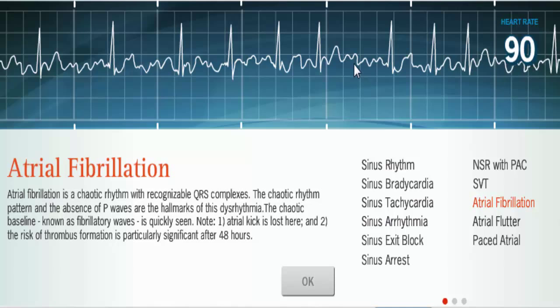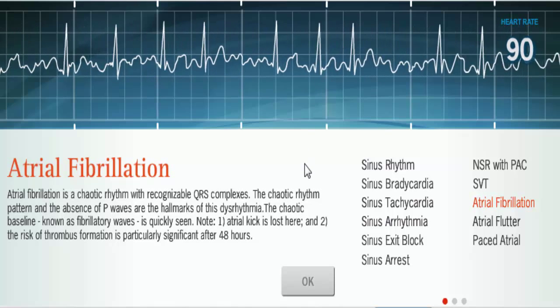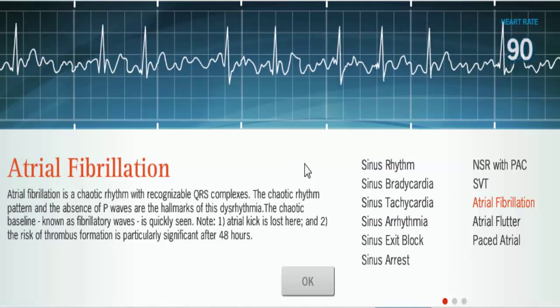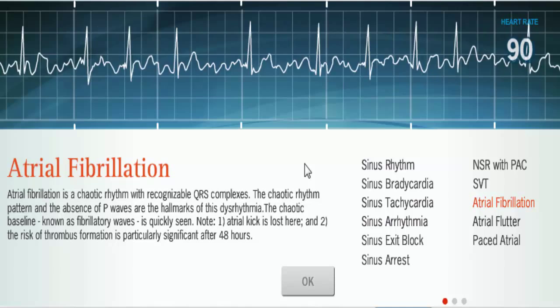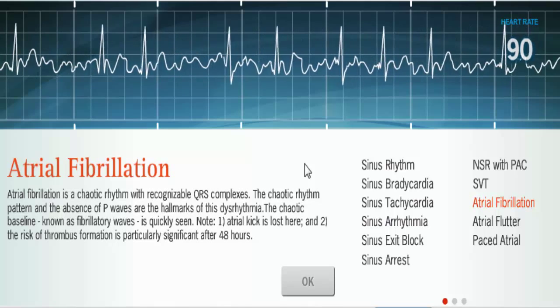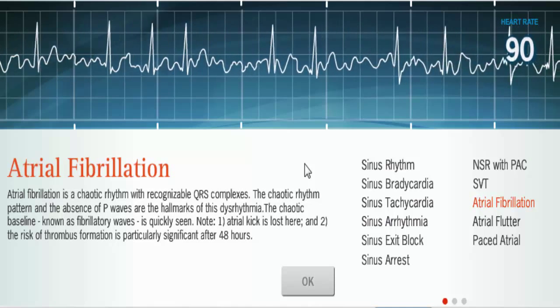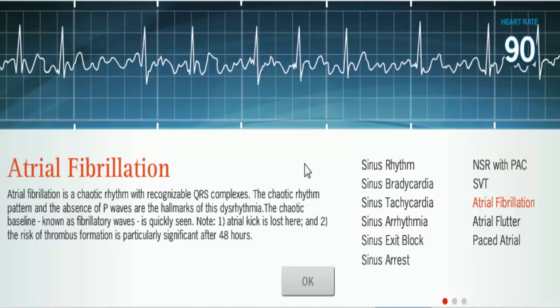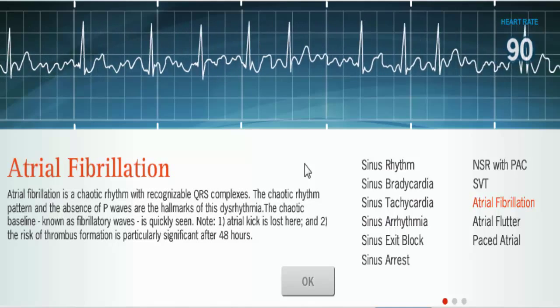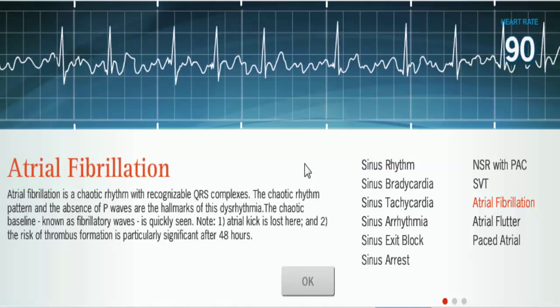Atrial fibrillation, as opposed to atrial flutter, involves very chaotic electrical activity in the atria. There is no definite P wave — instead you have very tiny fibrillatory waves. When we talk about atrial arrhythmias, we're talking about P wave abnormalities, because the P wave represents atrial depolarization. With fibrillation, the chaotic electrical activity in the atria means there is no defined P wave.